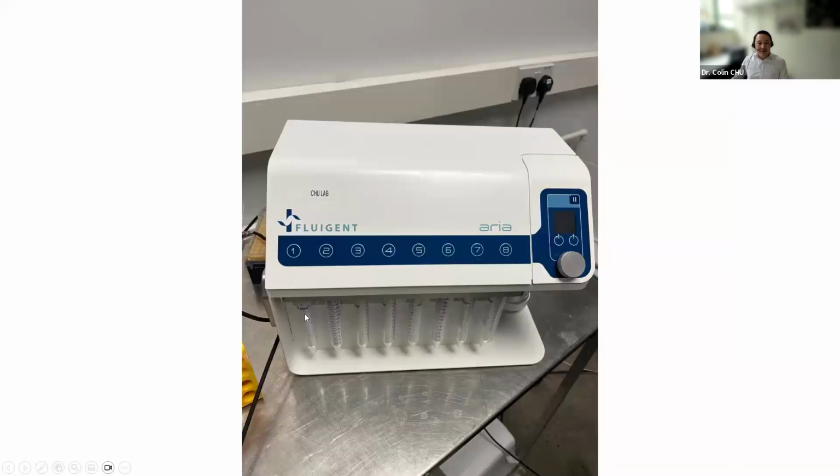The Aria, as you can see, hopefully here, there are 8 tubes at the front, which are just 15 mil Falcon tubes. And actually, the tubes come right to the bottom, so we can dispense even very small volumes. So, for example, in each of these tubes, we would put the different antibody cocktails for the different rounds of staining in each one, and it would only be around 200 microliters. And that was sufficient to be picked up.